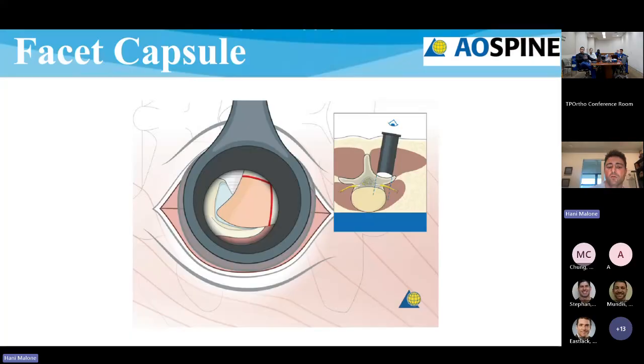I usually like to start with a traditional laminotomy, and then I'll take that laminotomy up to basically where I see the end of the ligament. Or if you're using navigation, you can really figure out where you are. But you basically want to take all of the bone off, hemilaminectomy and IAP removal, from pedicle to pedicle. When you get to the end of the ligamentum flavum, that usually means you can come straight laterally, and that'll get you across the pars and keep you below the pedicle of the level above and get you what you need.